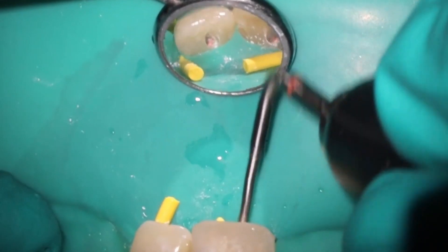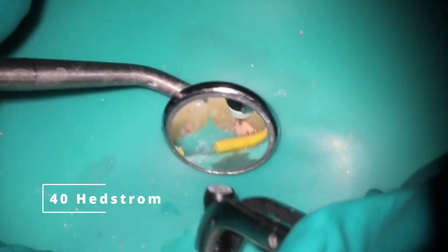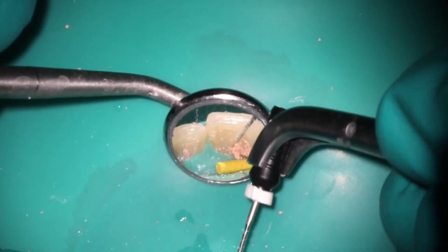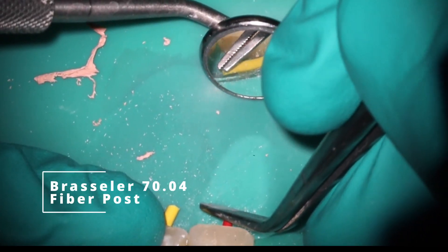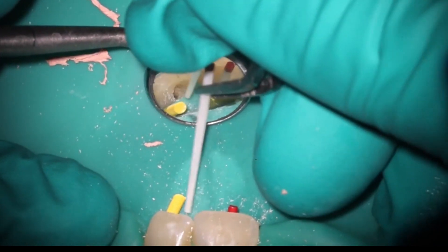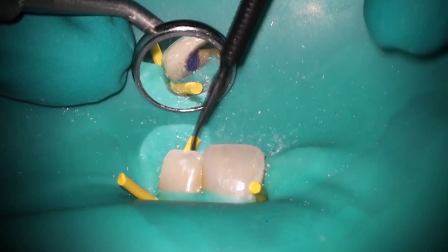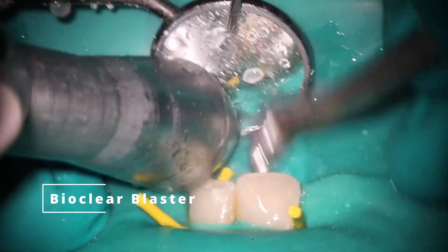I like to do posts in cases of anything on the anterior and premolars because I never know what exactly is going to happen to this tooth — it's a great way to help prevent snap-off fractures. It's going to take forever, so I'm going to use my headstrum and just add a little music because it took about two or three minutes. The problem here is the access hole was really tiny, so the gutta percha just doesn't want to come out. I'm also going to use slightly larger posts — I normally use the 50-04 or even the 40-04s, but in this case I'm going to make it a little bit bigger. I sped up a lot of the restorative aspect — if you want to know more about it, you can watch my other videos or drop a comment.